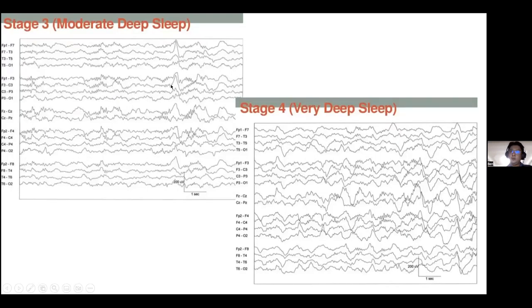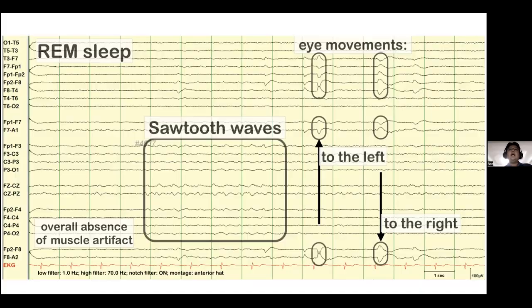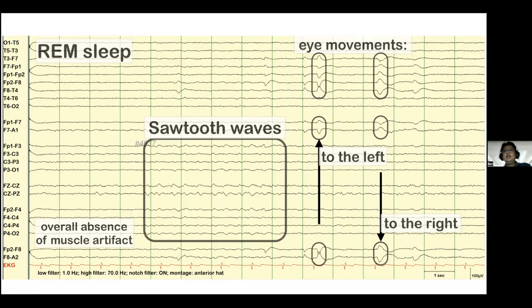Going into further sleep, slow waves start to appear — this is known as slow-wave sleep, formerly stages three and four of non-REM. After non-REM, you go into REM sleep, where the eyes are actively moving. The background activity shows a theta saw-tooth morphology, especially over the central region. There is an overall absence of muscle artifact, and EMG recording during this stage should show atonia.